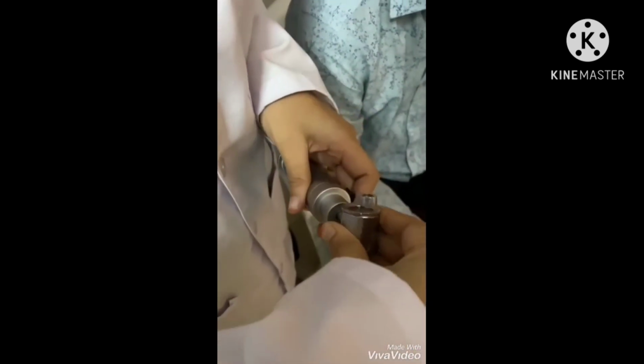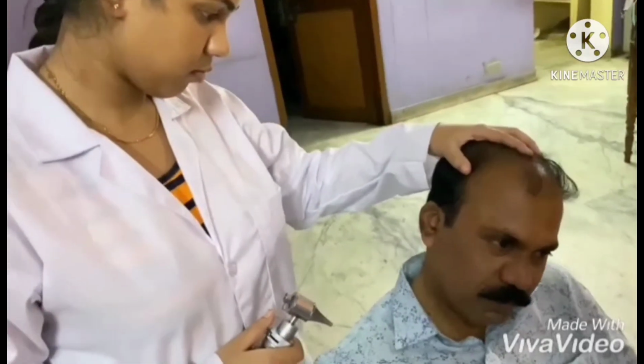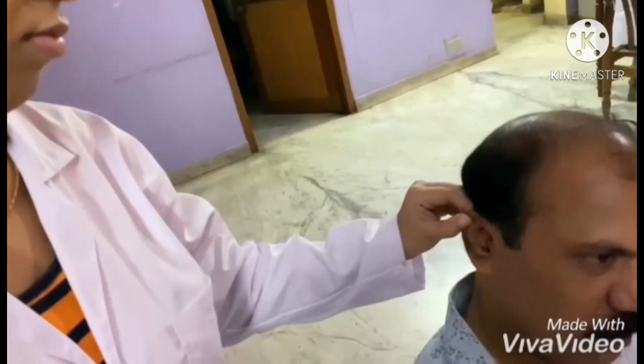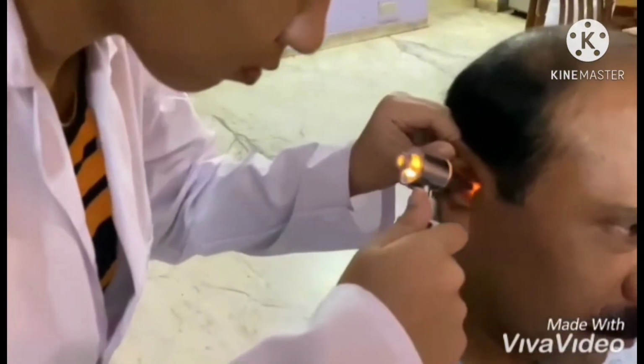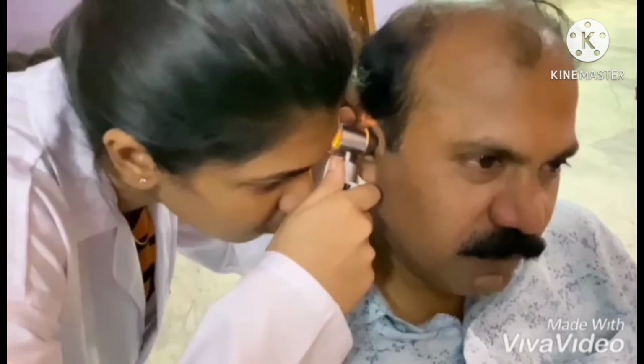Now, examine the eardrum and ear canal using an otoscope. To do this, select the largest speculum that a patient's ear canal can accommodate. Position the patient's head so that you can see through the otoscope comfortably. Straighten the ear canal by grasping the auricle gently and firmly. Pull it upward, back and slightly away from the head.